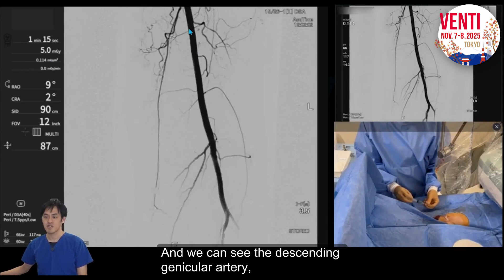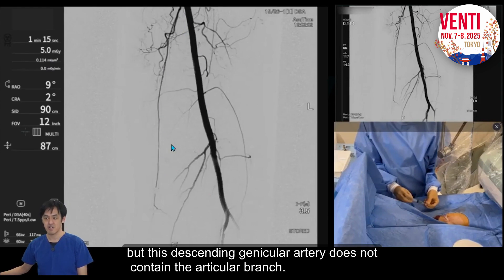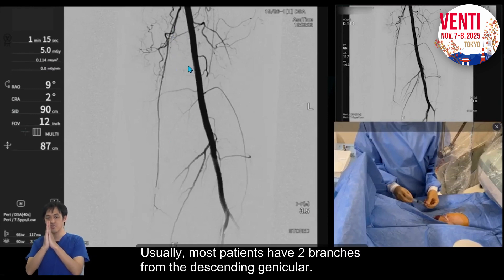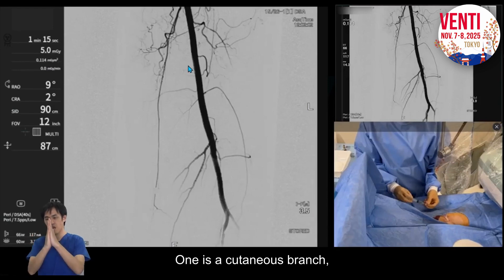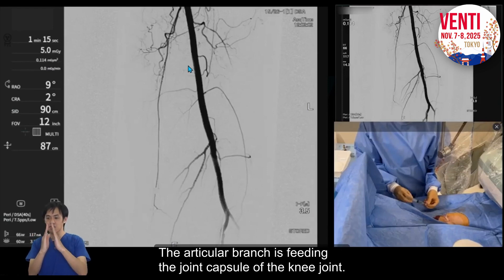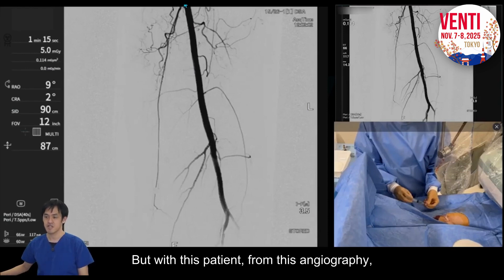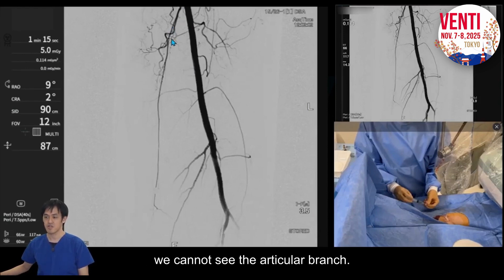We can see the descending genicular artery, but this descending genicular artery does not contain the articular branch. Usually most patients have two branches from the descending genicular: one is a cutaneous branch, the other is an articular branch feeding the joint capsule of the knee joint. But from this angiography, we cannot see the articular branch.